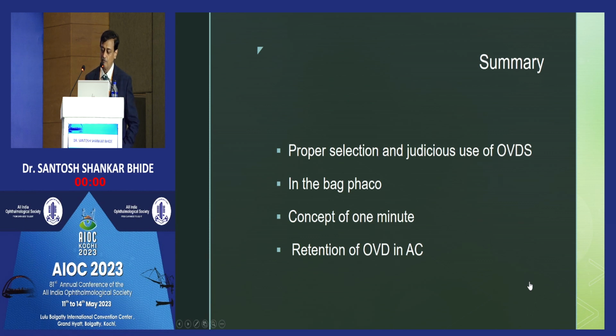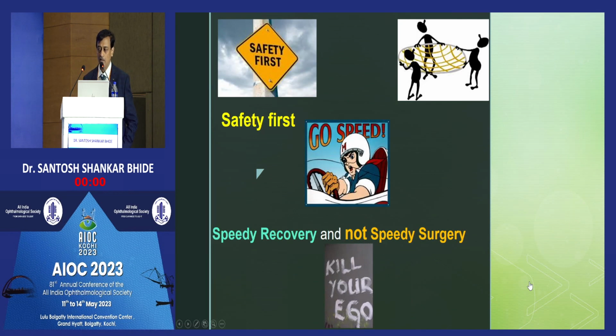There is a concept of 1 minute phaco by Dr. Abhay Vasavda, which is very useful. And the most important thing is that you have to maintain the anterior chamber with viscoelastic devices. We have to achieve speedy recovery of the patient and not speedy surgery.